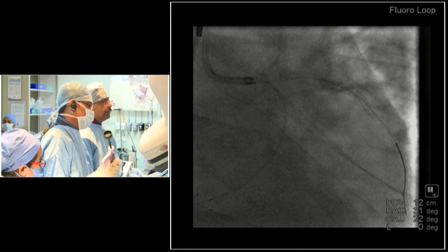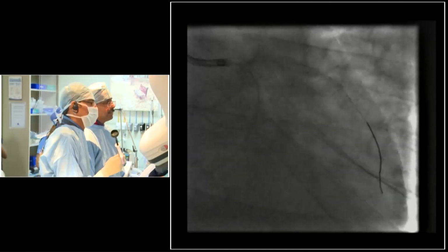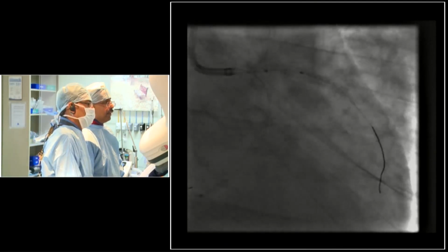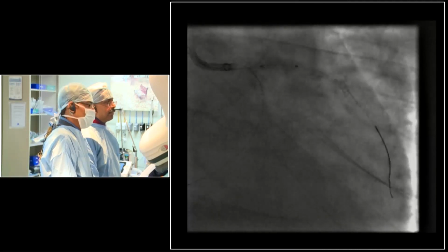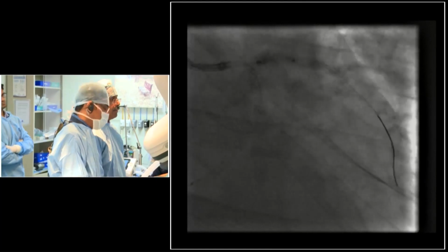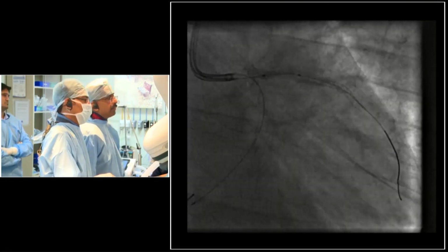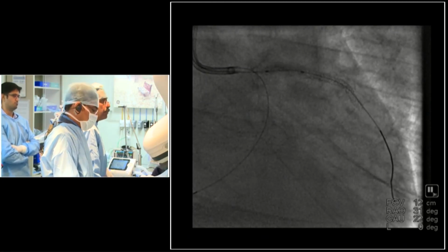In a stable patient, rotablation would have been ideal. So now you are going to take the normal NC balloon, not that special Trio NC balloon. Yeah, normal NC. Already we used a lot of balloons in this patient. So 22, 24 with a 3 millimeter. Okay, I want a Cine Vision, please. So we're just using a cine vision to check whether the balloon has come up well.